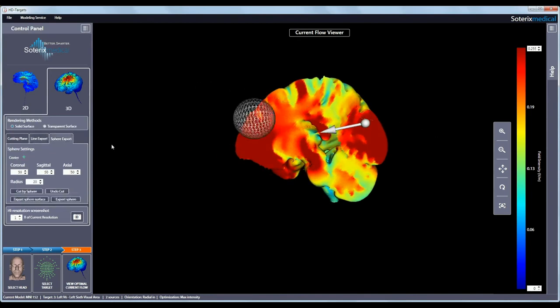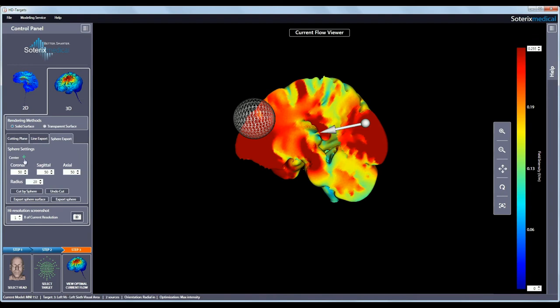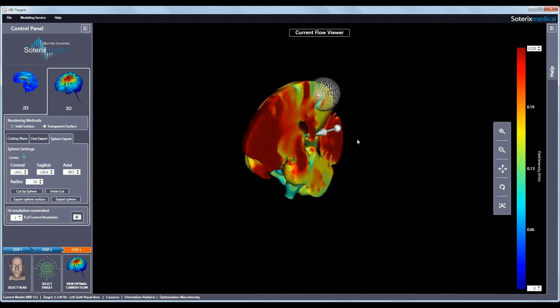Similarly, the sphere export option lets you define a sphere anywhere in the 3D volume and export the induced electric field values to a text file. You define the center and the radius to define the spherical extent and then hit cut by sphere to export the induced values.